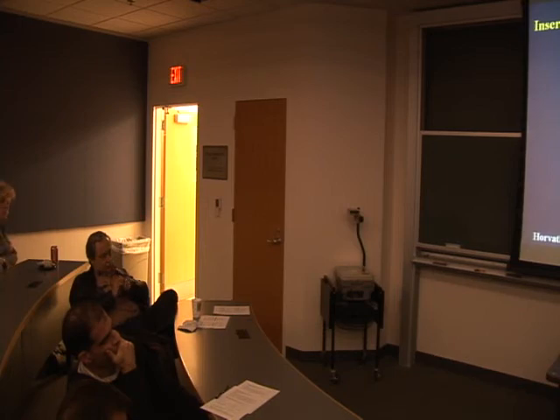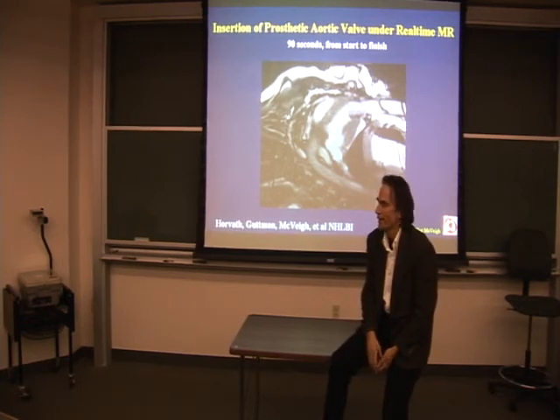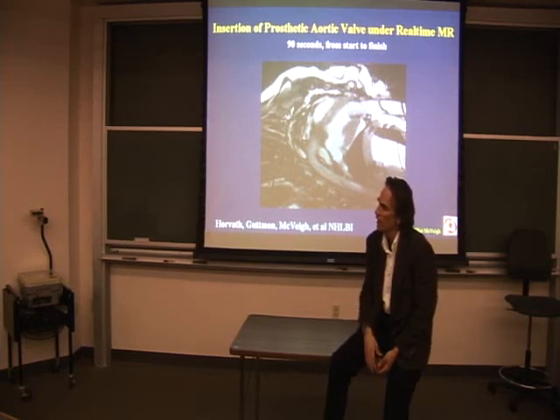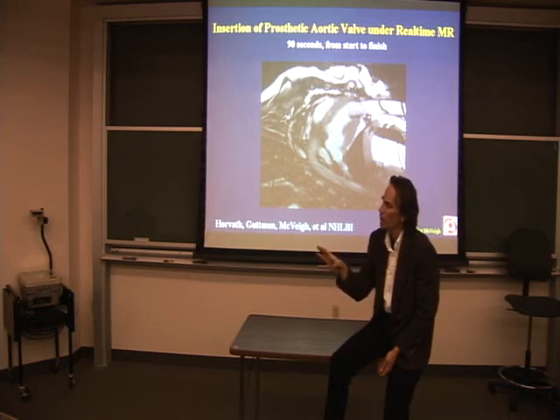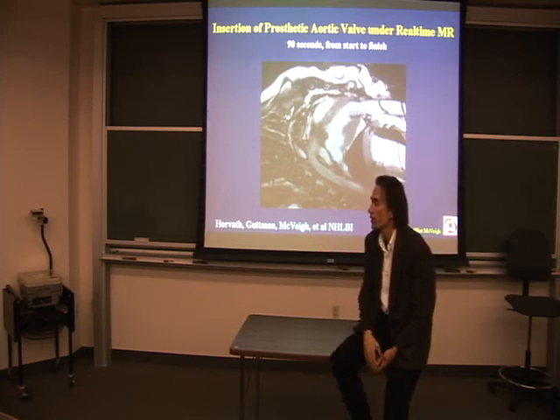Well, we can image a catheter to within the imaging resolution of MRI. The deal there is how do you, in real time, image where the pulmonary vein is. Because to get really good pulmonary vein imaging from MR, you usually use contrast to get a blood cast, with this bright signal. To do real-time imaging of the pulmonary veins is slightly more challenging. But I'm fairly confident you can do real-time imaging of a linear catheter. So all we have to do is put an active element all the way along the catheter, and that's what we know we can figure out from that.